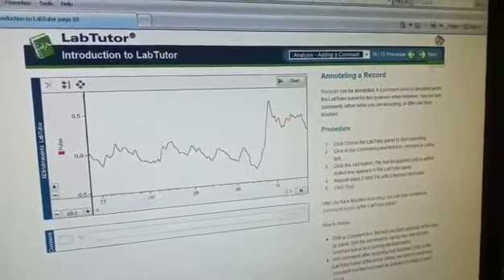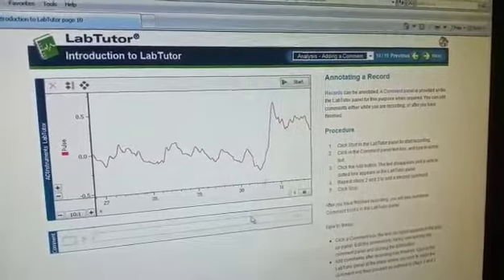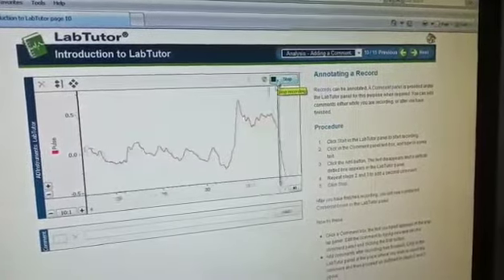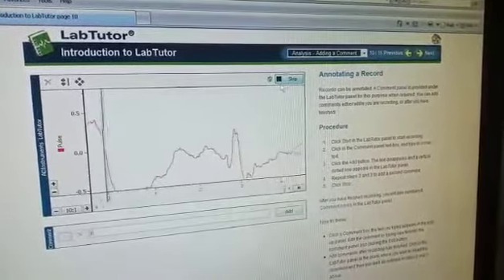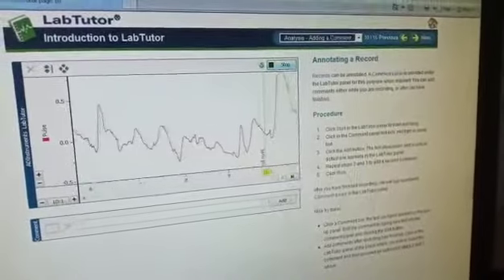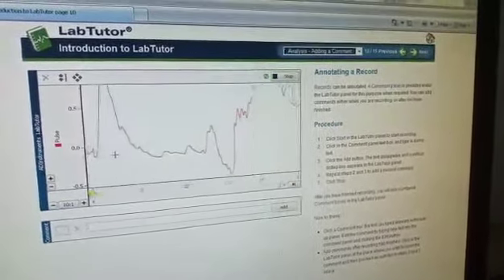Okay, you can also write comments during the recording. It can be done by clicking the start button, starting the recording. And let's suppose I'm saying that this is the recording of roll number 45. Now the roll number 45 is appearing here.